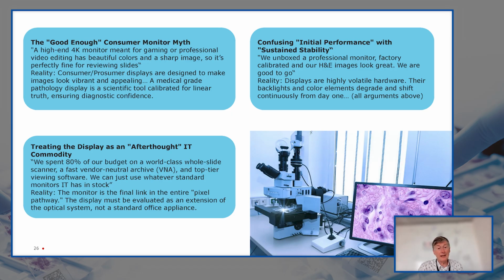The second one is very much related to this, and it's really comparing the initial performance to the sustained stability, because you might have a nice display that looks great in the beginning, but then what I just told you happens over time. Luminance goes down, the color is shifting. If you don't have that under control, you are basically looking at a moving target.